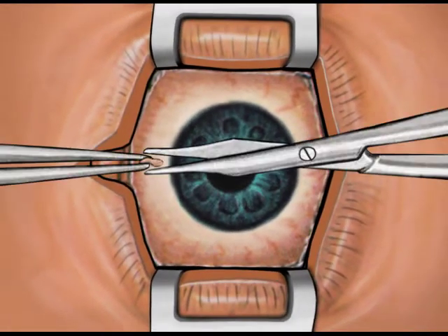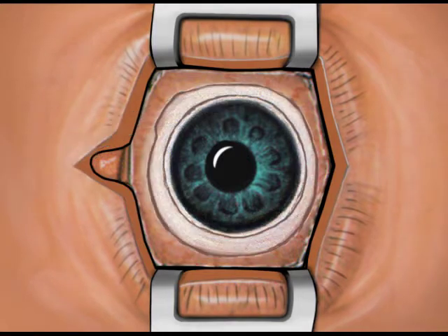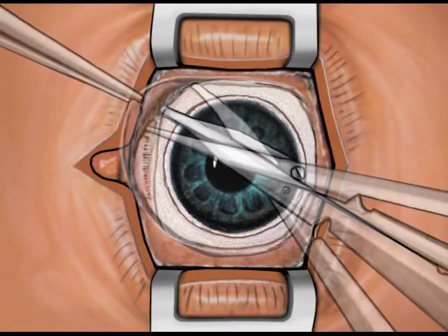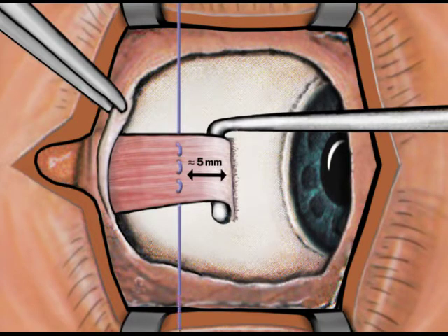Begin this procedure by preparing the eye for a standard enucleation. The primary objective is to isolate and tag the four rectus muscles. Tag each of the four rectus muscles with a double-armed 5-O Vicryl suture with an S24 needle, approximately 5 millimeters from the muscle's insertion to the globe.